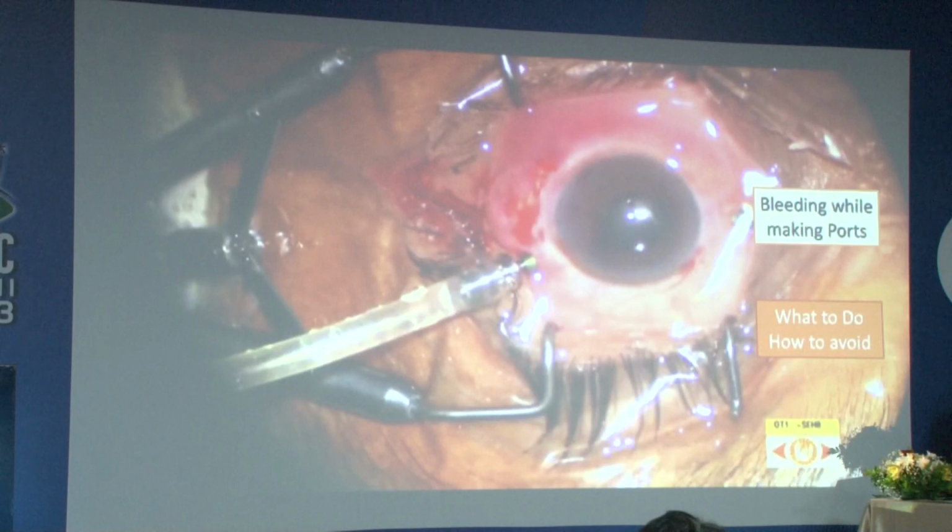Apart from anticoagulants, patients may be on antiplatelets. If there are areas where you can see anterior traction, you avoid those areas. That can be made out if you can see the periphery. Also in resurgeries, for the youngsters, avoid the site of the previous port. Just go away from it, because that is the site which is going to have a problem.